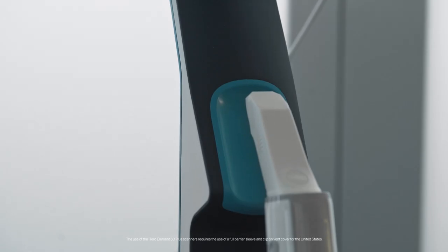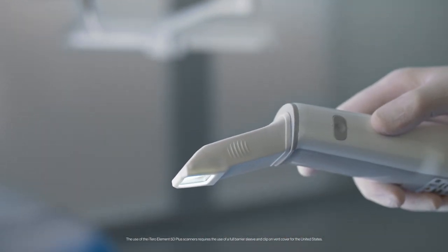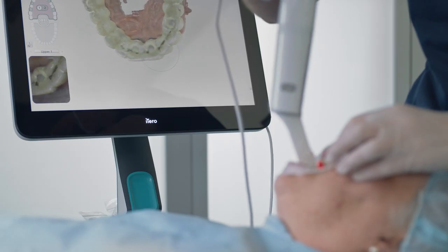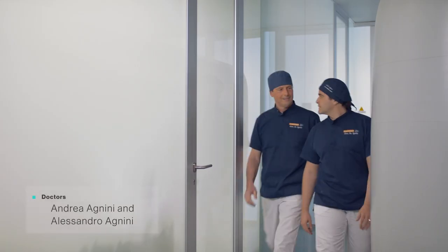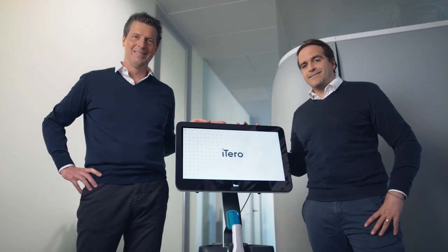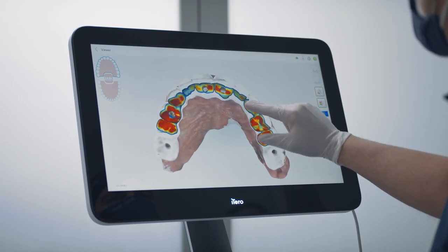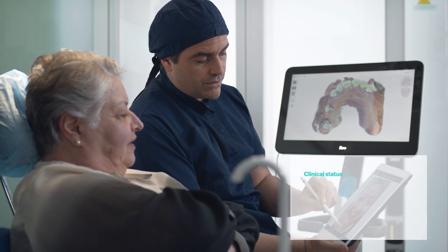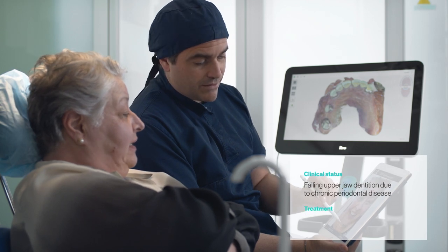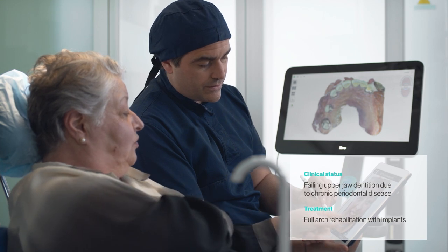With roots in restorative, iTero's versatile scanners are designed to streamline and enhance a range of digital workflows, like full-arch rehabilitation. Dr. Andrea Annini and Dr. Alessandro Annini will demonstrate just how intuitive the digital workflow for full-arch rehabilitation with implants can be. This patient came with a failing upper jaw dentition due to chronic periodontal disease, and the chosen treatment approach was a full-arch rehabilitation supported by six implants.